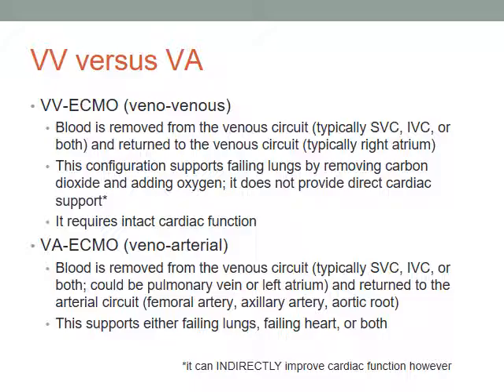So if you have a fundamentally failing heart, VV ECMO will not work. If you have a heart that's not happy because of high ventilator pressures or because of hypoxia, VV ECMO by itself may support a failing heart. Make sense? That's one of the big decision points we have on every patient: is it VV or VA? Sometimes we say, maybe VA, but I think VV might be enough. So we'll start VV. We can always add a VA circuit if we need to.